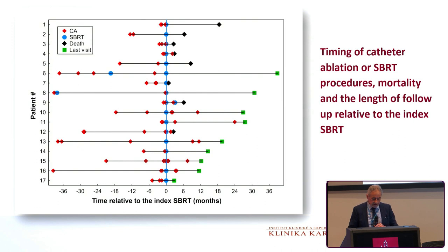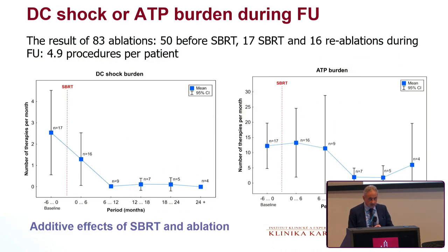And this is the timing of catheter ablation or SBRT procedures. This is the SBRT first procedure, and you see that before they had a different number of ablations. Sometimes there was one before, and there are reablations after. And this is the last visit, so some patients died very early, some patients had reablations, so it's not a cure for the patient.